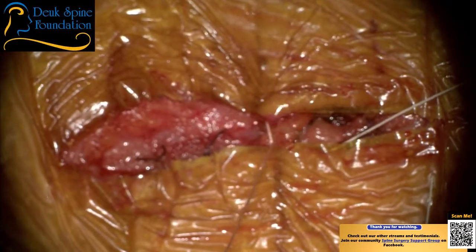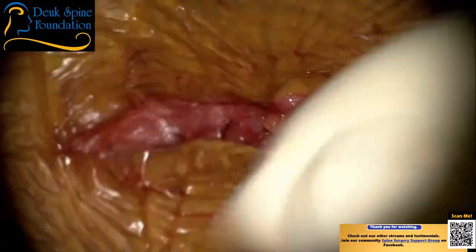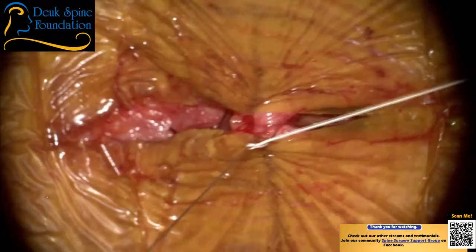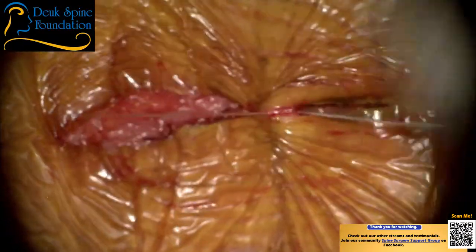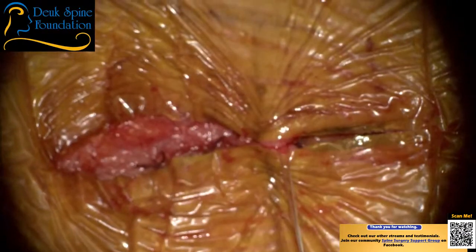Okay, watch it. Watch the needle. Yes, sir. Are you okay? You good? Now, this is a very important layer in surgery, the skin. A lot of people don't understand how important it is.